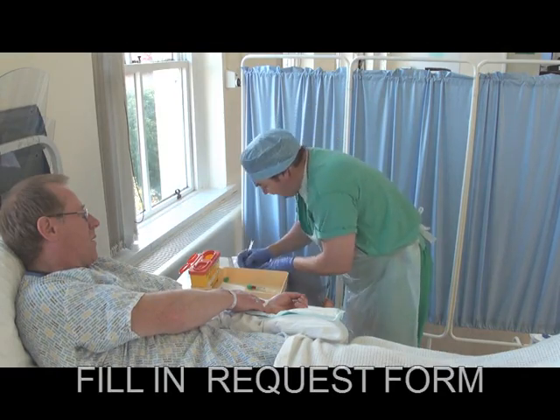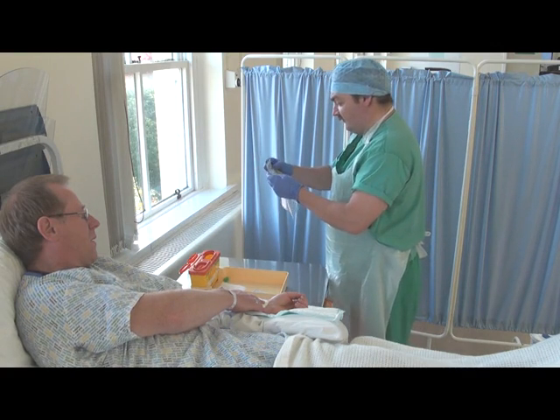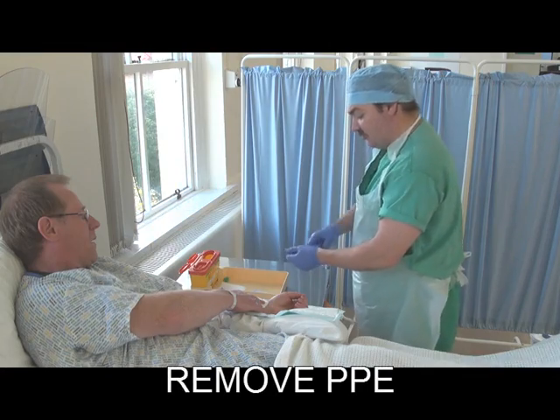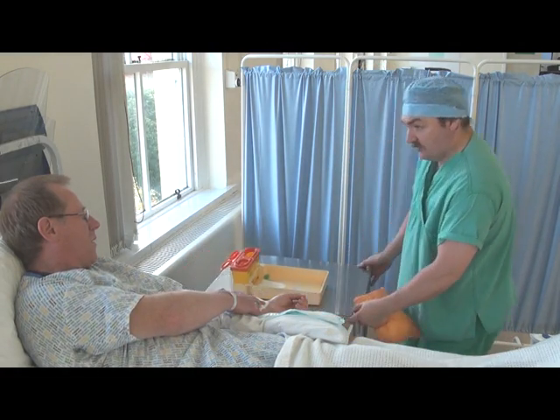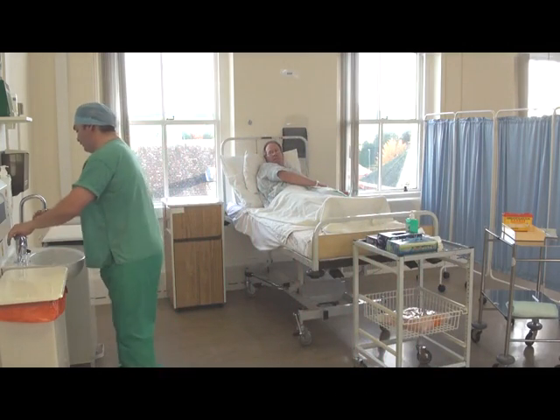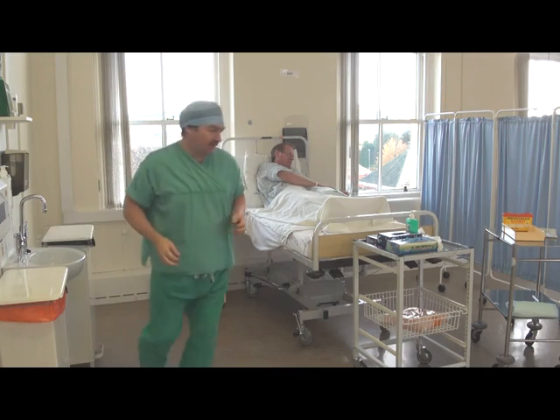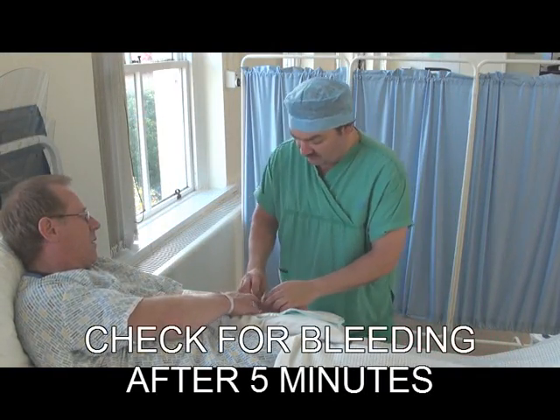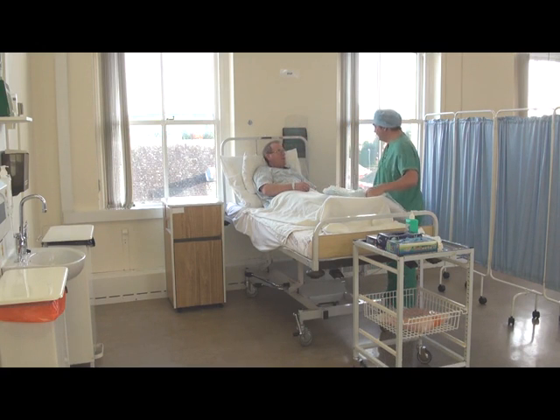Next, fill out the appropriate blood form or take the sample to the nearest blood gas analyser. Dispose of gloves, then your apron in that order. Dispose of any waste into an orange waste bin. Finally, decontaminate your hands after the procedure. Ensure the site isn't bleeding and ask the patient to report any pain or discomfort. Finally, document the procedure in the patient's notes.